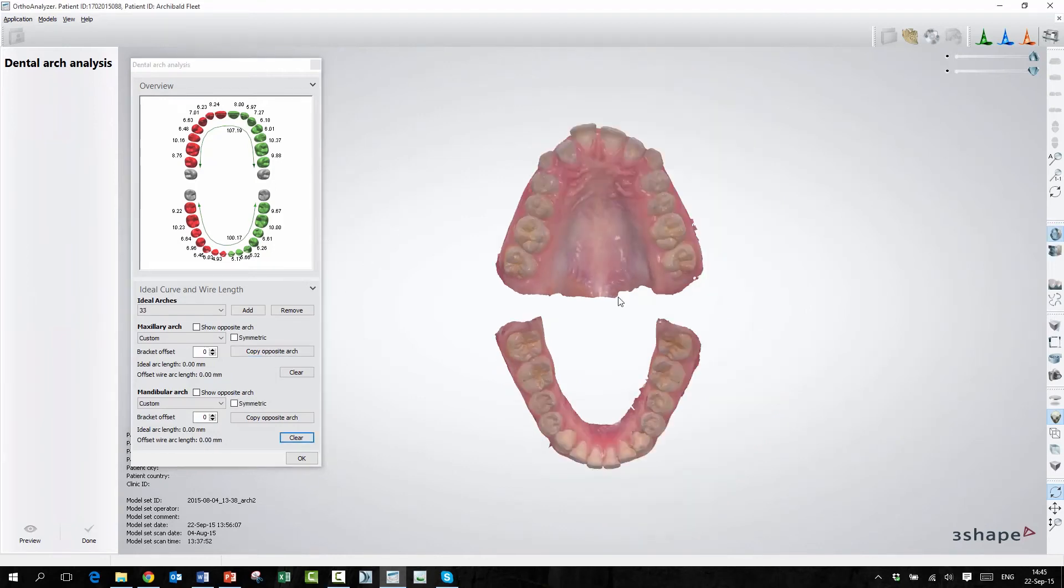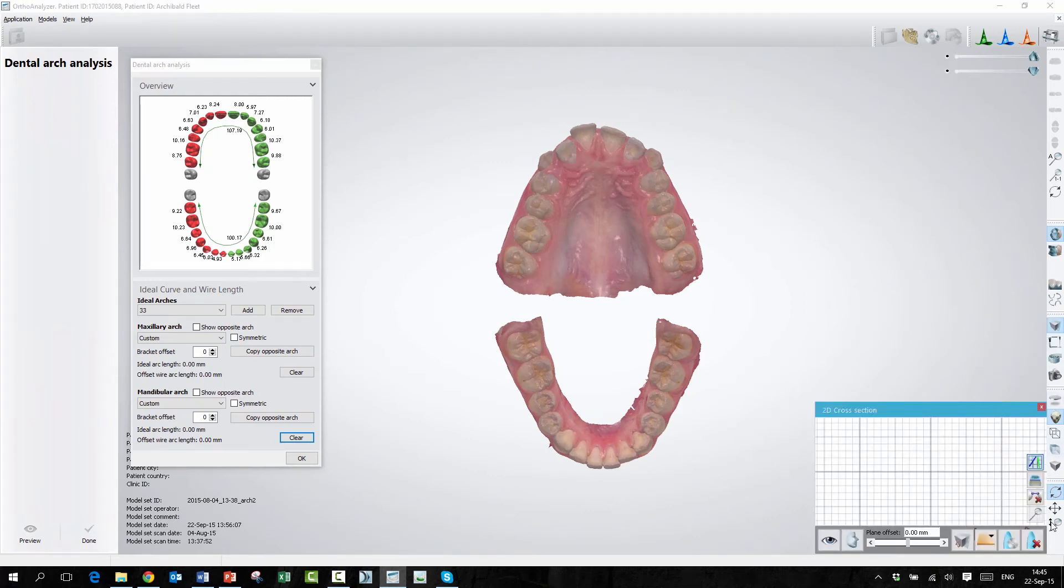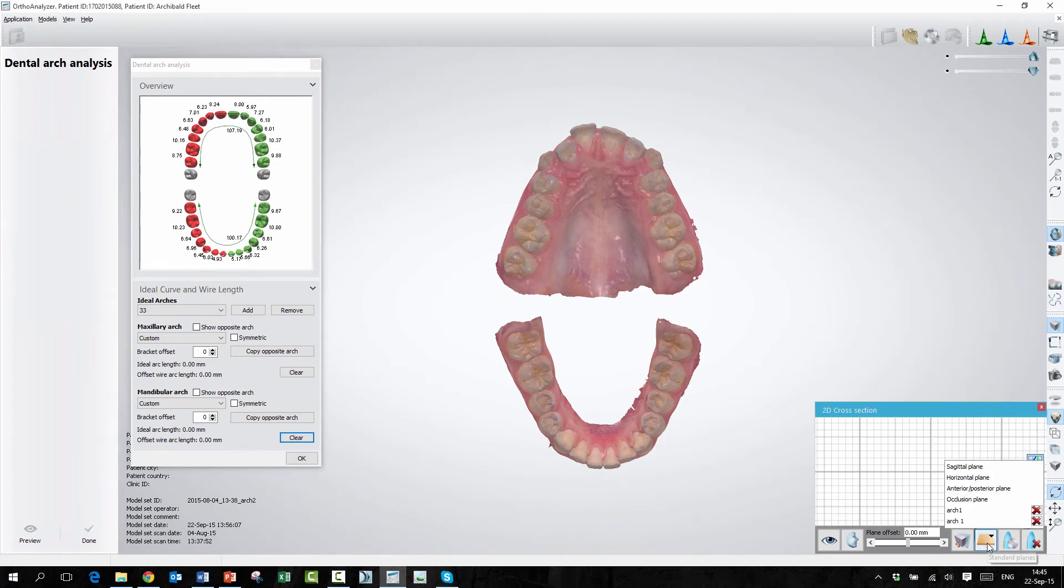We also have the feature where we can overlay a 2D image on top of our arch and we can draw from it here. So I will take the cross section, and that's a normal cross section tool that we have a video on.